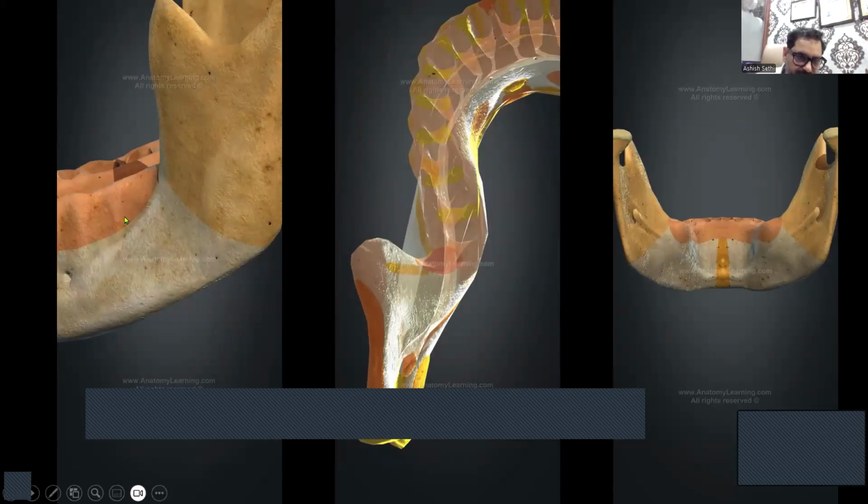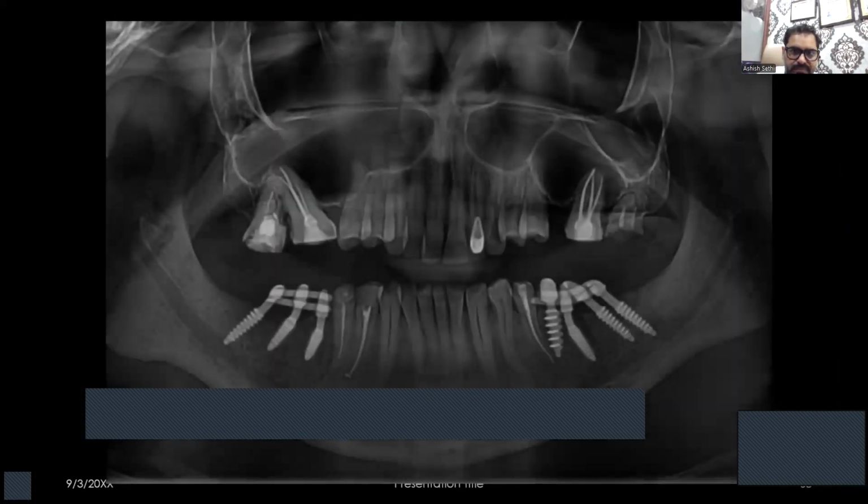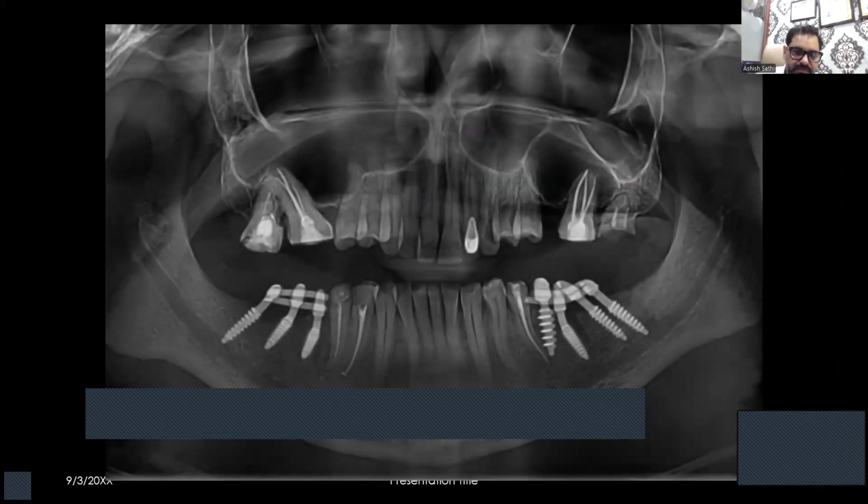This is your माइलोहाइड. या तो हम इसके नीचे एंगेज करते हुए आएंगे बोन को. This is another view of the माइलोहाइड. हम एक्सरे व्यू है जो नीचे से इसको यहाँ से निकलेंगे, यहाँ से निकलेंगे. This is your lingual cortical. This is your buccal cortical, lingual cortical.